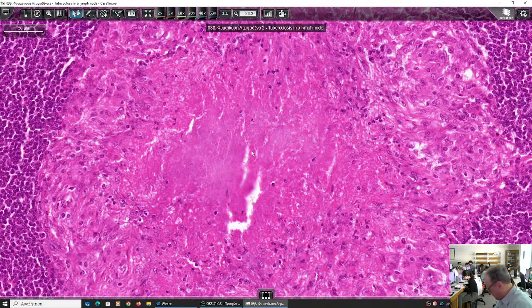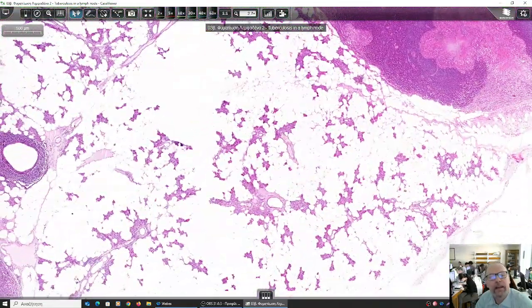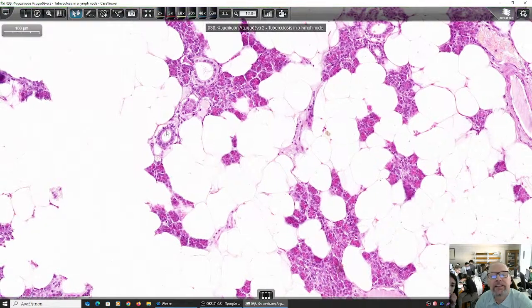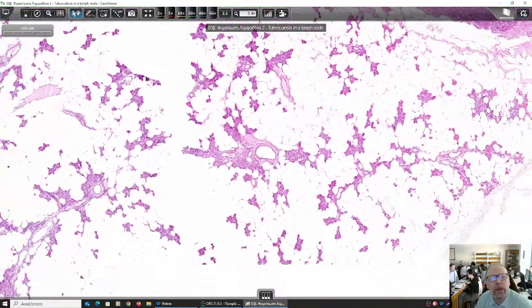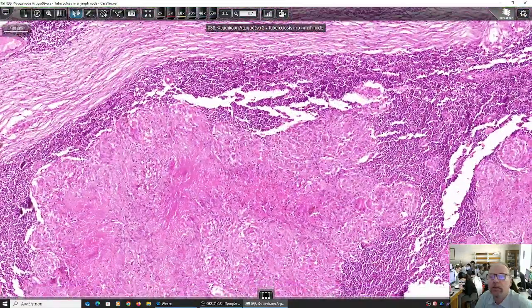But sit here, don't go yet, because I want you to show something else. This is the lymph node parenchyma. This is salivary gland tissue. Here we have some epithelial acini, salivary gland, and these are ducts. It's most probably either, how is this called? The parotid here, and this is submandibular probably because it's close to the cervical lymph node. So if you surgically remove a lymph node from the neck, you might get some parenchyma of the adjacent submandibular salivary gland. So this is epithelial tissue, and there is an increased amount of fat cells. Let's have a look at the granulomas.